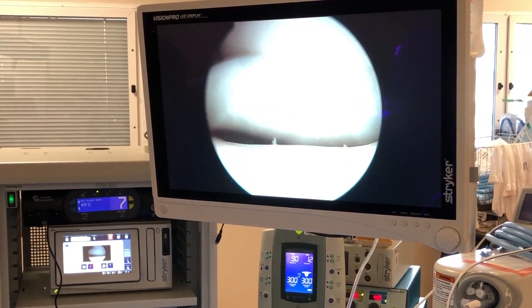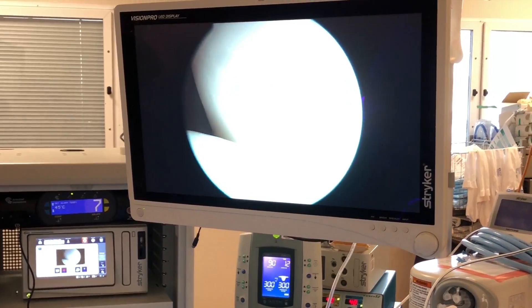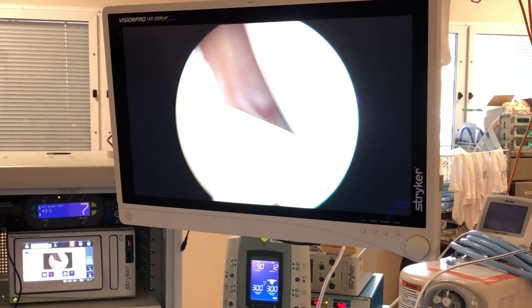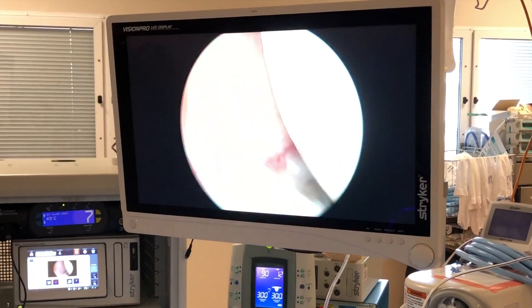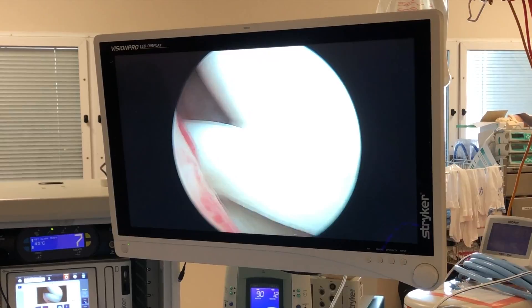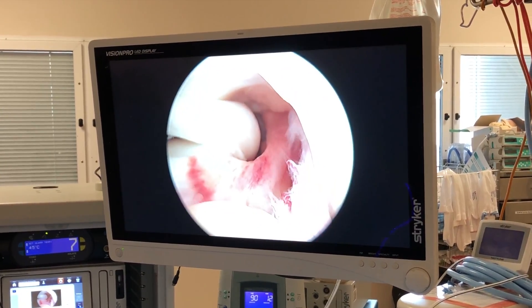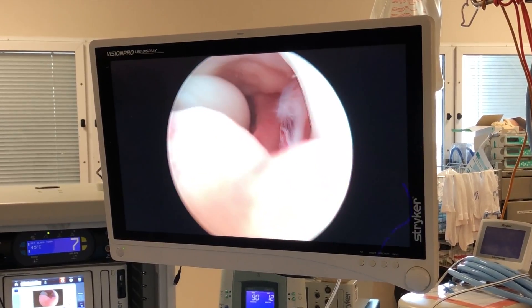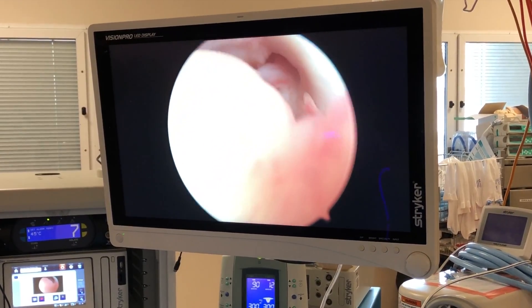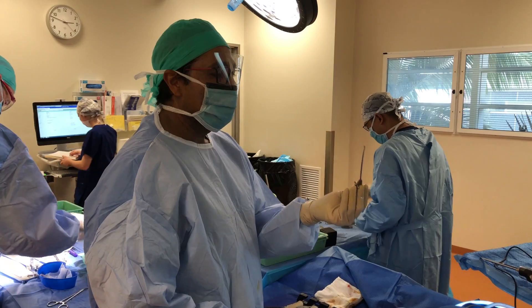If you look over here, you can see it's jamming. This is where the meniscus has torn from the back — it's sitting in the front and has to go back. And there's an ACL rupture in here, you can see the rupture there.